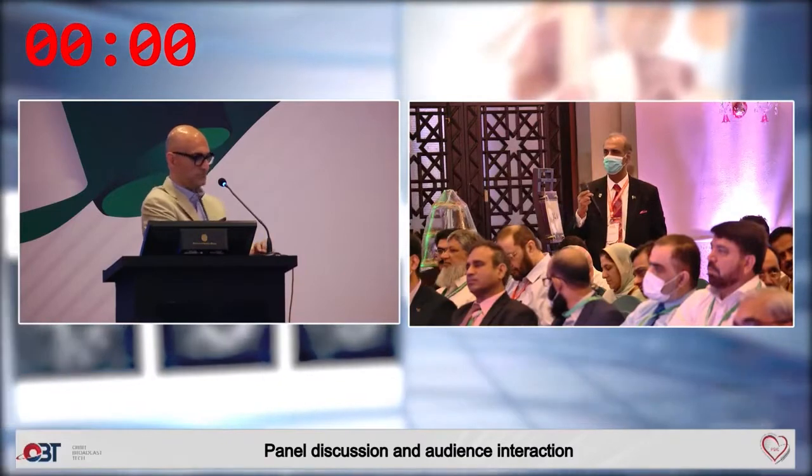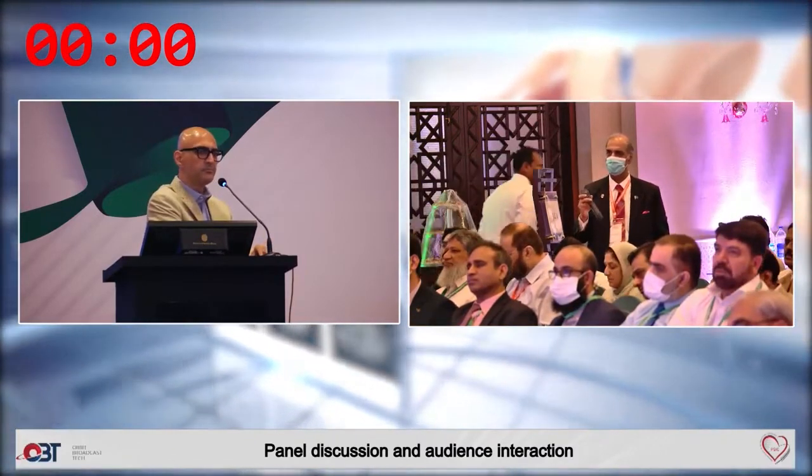So you don't need a biplane for TAVI. You can do a TAVI program with a monoplane; biplane is only, as Usman mentioned, for congenital heart disease. If your question is biplane for TAVI and structural heart, no, not for mitral clip, not for LA appendage closure, not for TAVI. For TAVI and mitral clip, you are basically doing it under transesophageal guidance. So that's a totally different ballgame. If you have a structural program, you don't need a biplane for it. You can do it on a single monoplane machine. Perfect. Thank you.